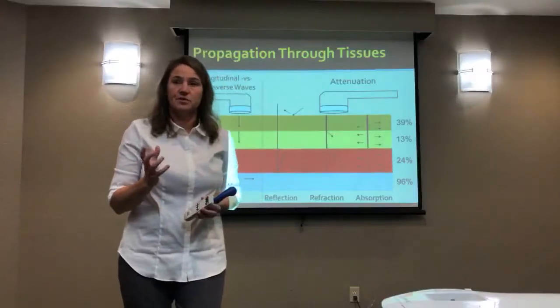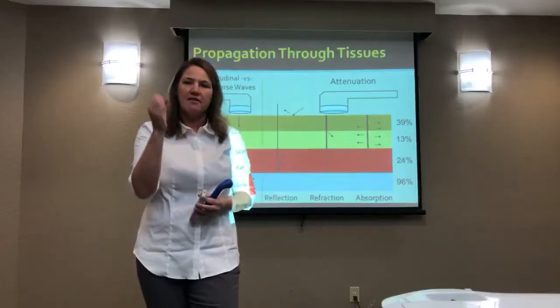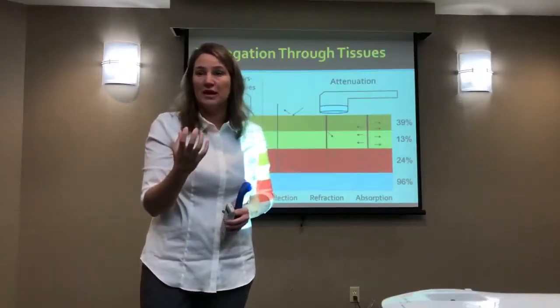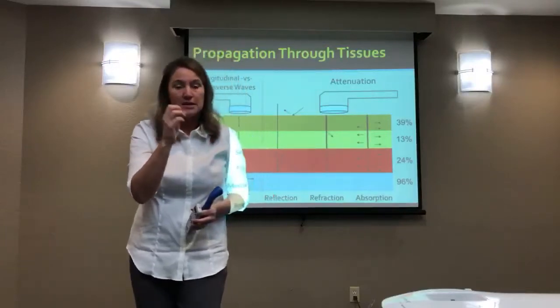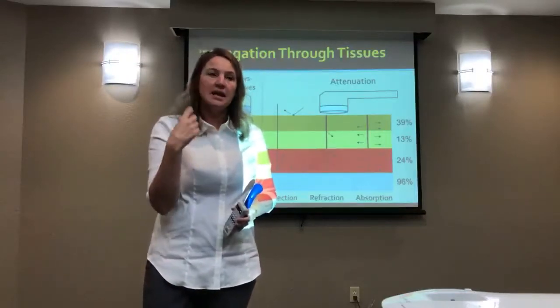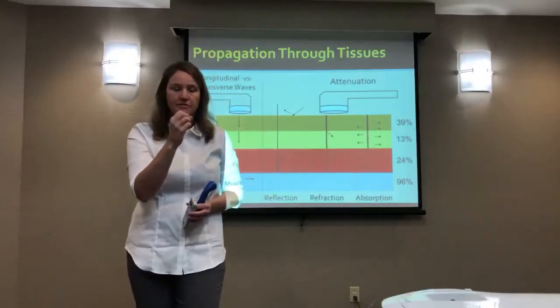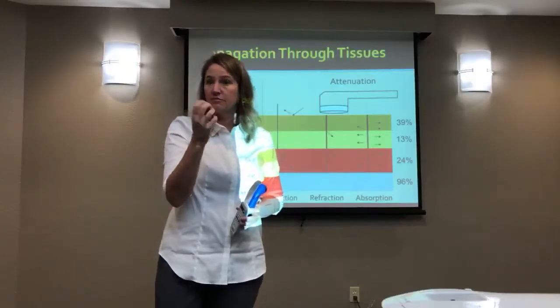And then there's absorption. So the third thing I want to talk about is attenuating through absorption. And the idea that every cell that gets vibrated keeps some of the energy with it. So it took energy to vibrate it. And sometimes that's all you're doing. That's the physiological effect we're looking for, is just to take that cell and shake it up a little bit. So to some extent, that is our physiological effect. Now, if that happens enough, the kinetic energy is absorbed, and if it happens enough repetitively, then the tissue becomes heated. So if that vibration occurs enough, that tissue starts to get heated up. So it's either just the act of shaking it, or the act of doing it enough.